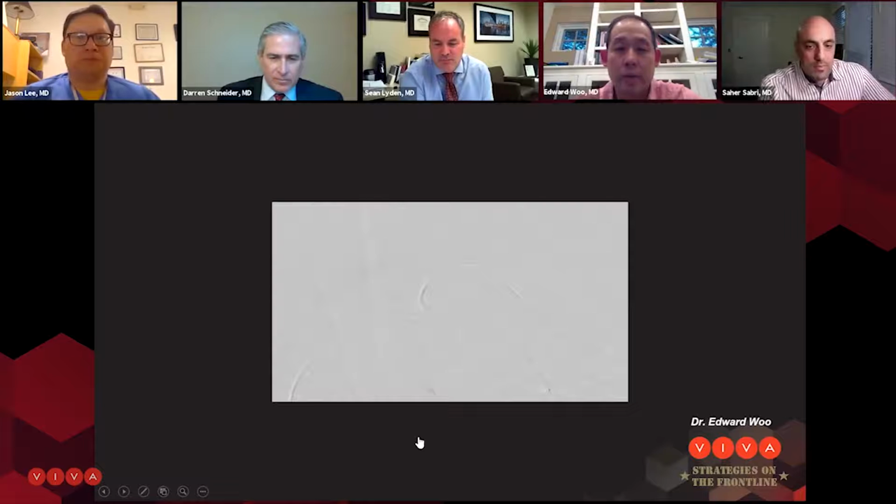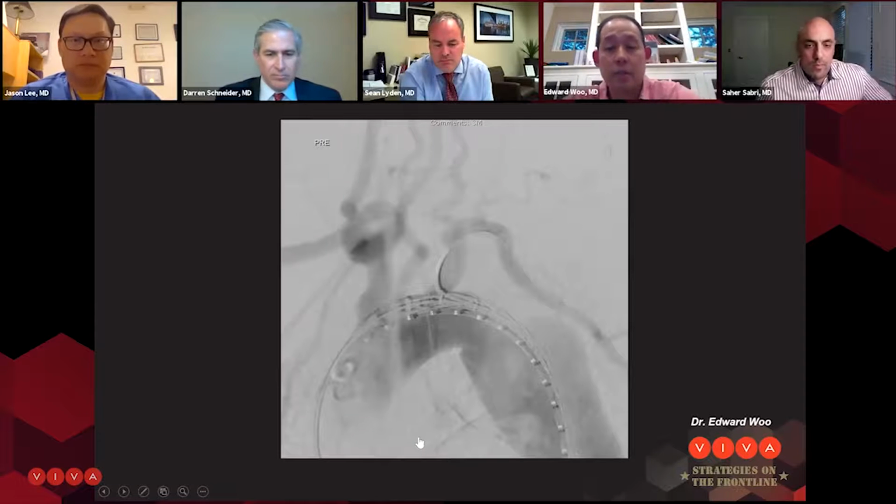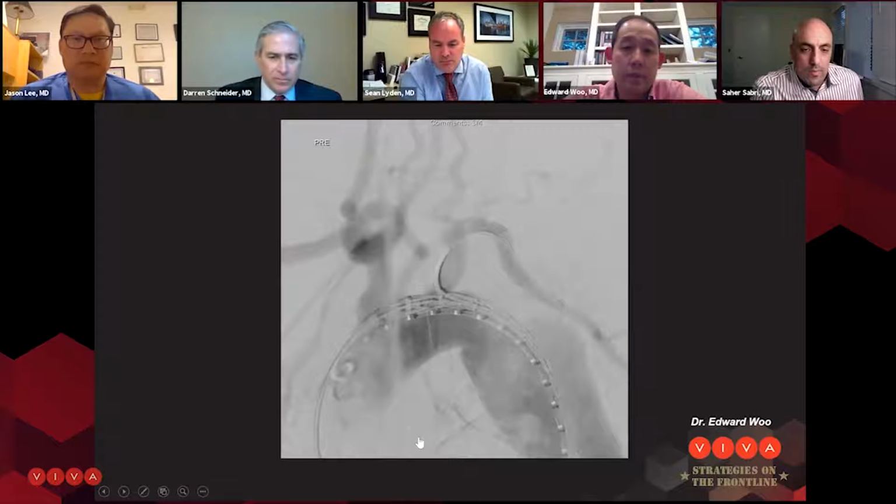And then with wire access from the groin through the radial artery to cannulate the branch of the TBE. And this is just a still image of what I was describing here. You can see the innominate artery, the left common. You can see the markers abutting the orifice of the left common carotid artery. Again, that wire with a catheter through that left subclavian artery.